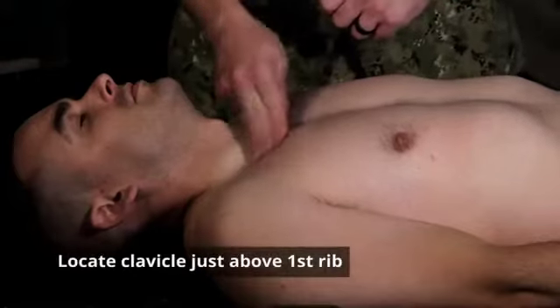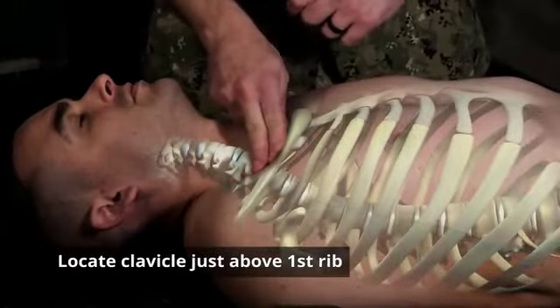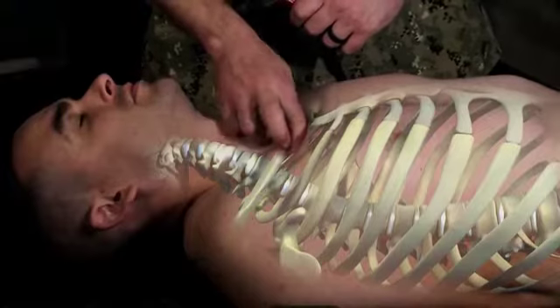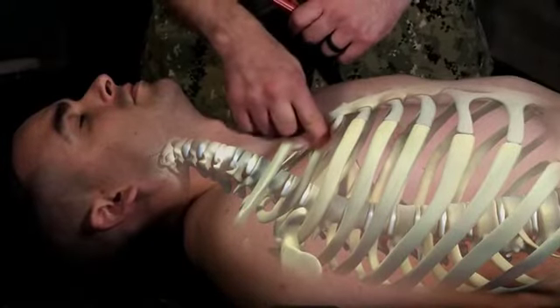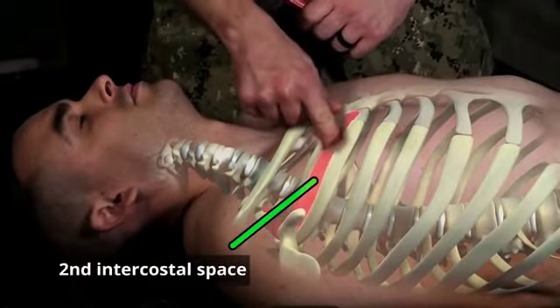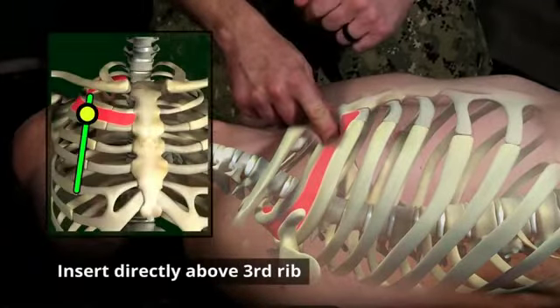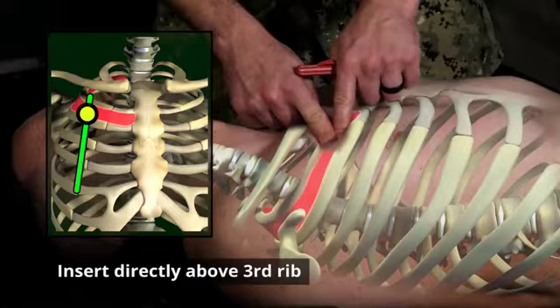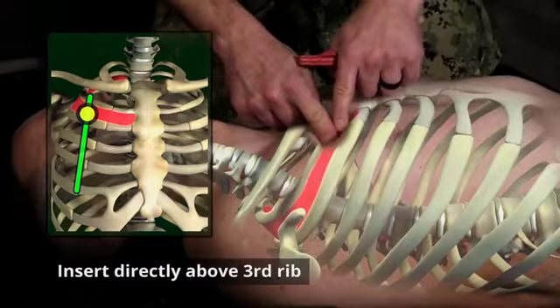I want to locate my patient's clavicle, which is also right above the first rib. Underneath that is the 1st intercostal space. Moving down, I find the patient's 2nd rib. Underneath that is the 2nd intercostal space. I'm going to insert my needle catheter here, directly above the 3rd rib, so that I don't hit any arteries or veins along the bottom of that 2nd rib.